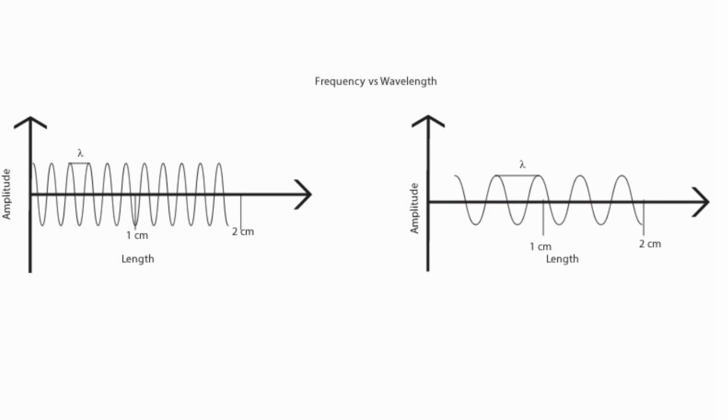You're right. The higher the frequency of the sound wave, the shorter the wavelength. And vice versa. The lower the frequency, the longer the wavelength. And again, you see the inverse relationship between these two values. And this would be another logical chain you must memorize. The higher the frequency, the lower the wavelength, and vice versa. And now let's move on to the next lecture.